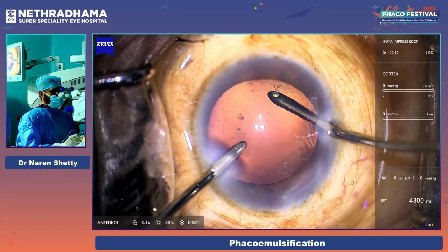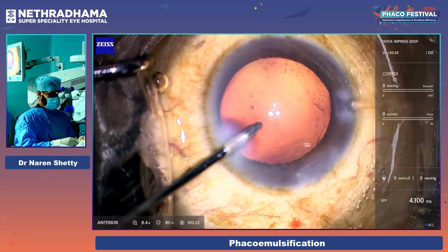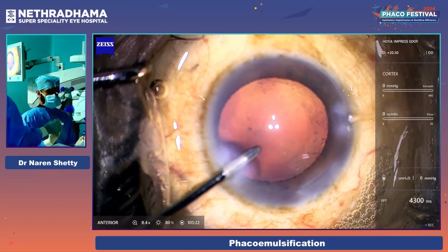See, you can make it out, right? It easily comes to the bag. So in these kinds of cases, you have to be extremely, extremely careful. IOL, please.